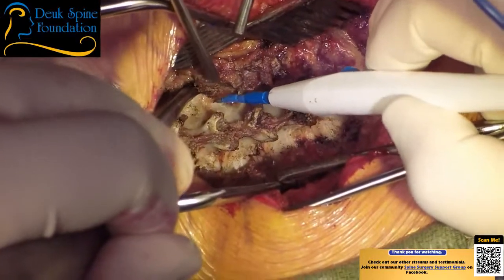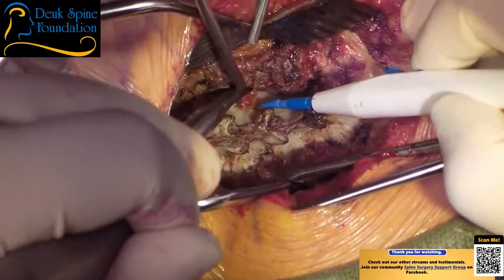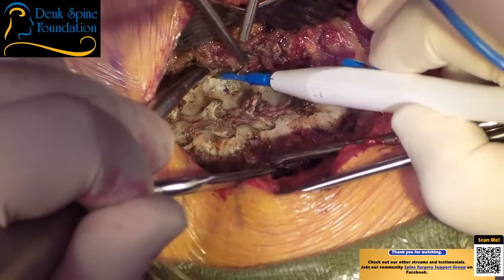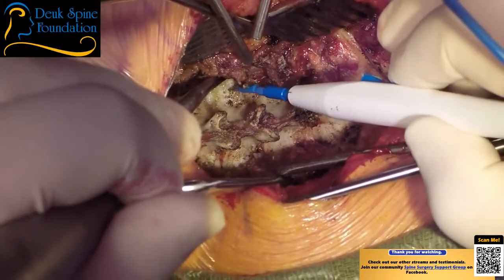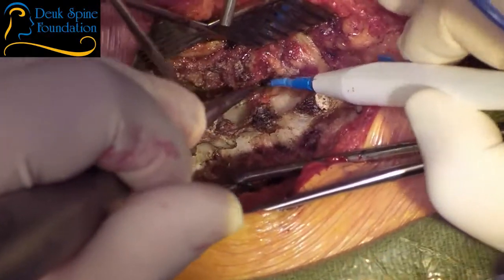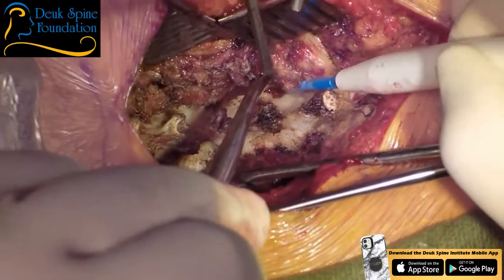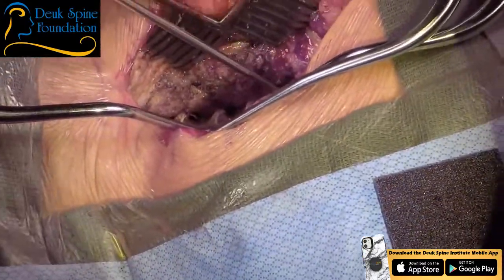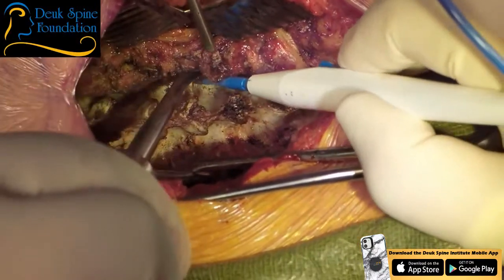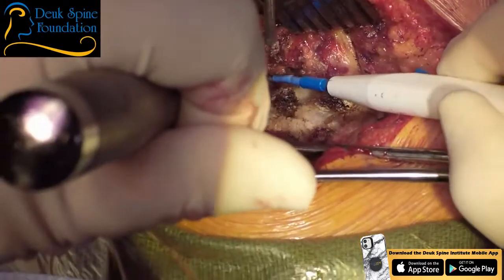There's something wrong. They're not intact. They look disrupted, basically damaged, which is not surprising. There's always a history of trauma before any type of degenerative process. I don't know what her specific trauma history would be. I haven't elicited that from her. Do we know? Has she been in a car accident or something? Two car accidents? Oh. Well, there you go. So a whiplash could certainly disrupt the posterior facet capsule, and that's what it looks like. There's really nothing there. There's no capsule at multiple levels.